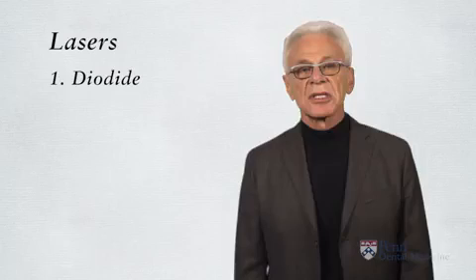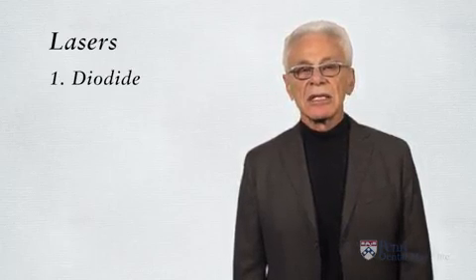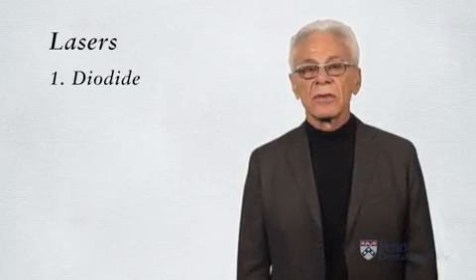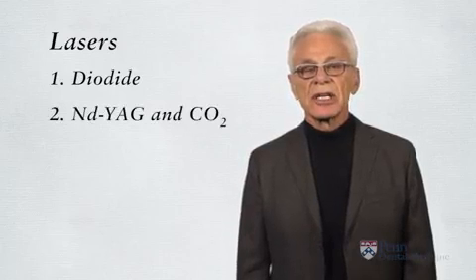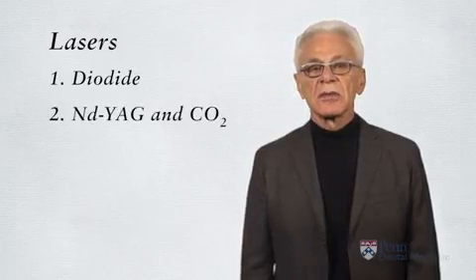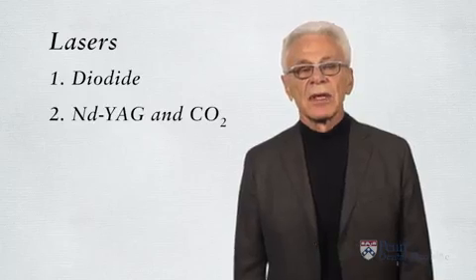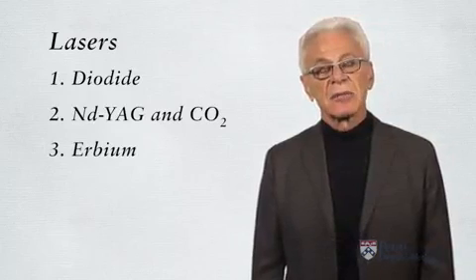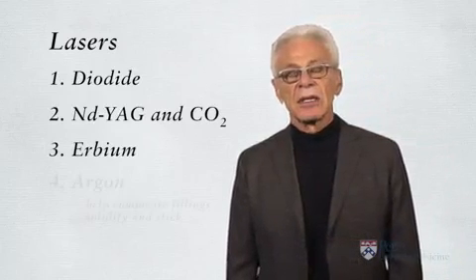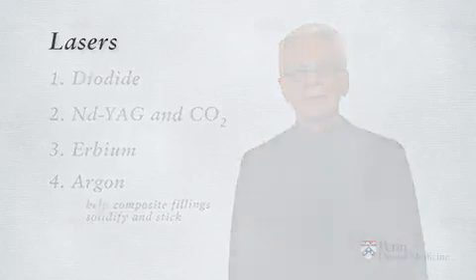We have 4 types of lasers. The diode, which is absorbed by pigmented tissues, such as the hemoglobin and melanin, and it is particularly good for treatment of soft tissue. There is the Nd:YAG and CO2 laser, which is excellent for hemostasis, for stopping bleeding. There is the erbium laser, which is good for hard tissue and hence can potentially replace the drill, and the argon laser, which can cure resins and improve bonding.